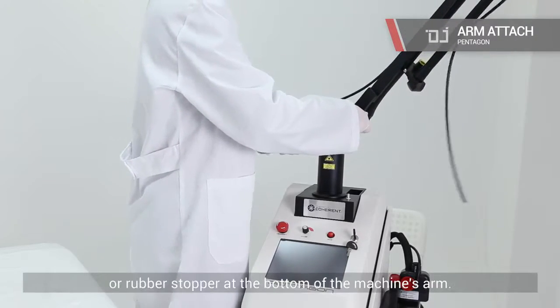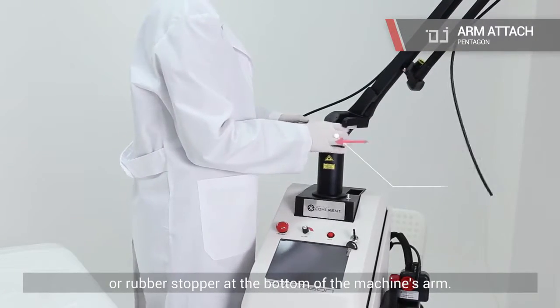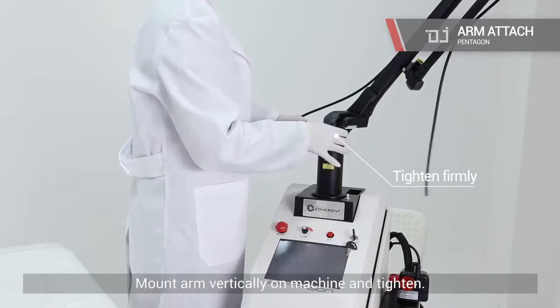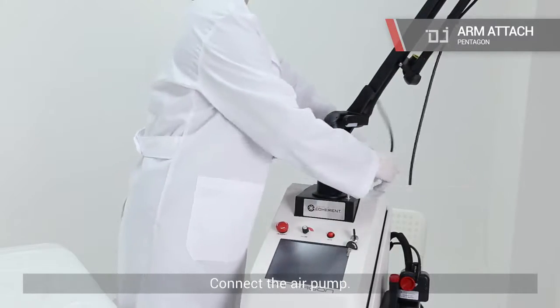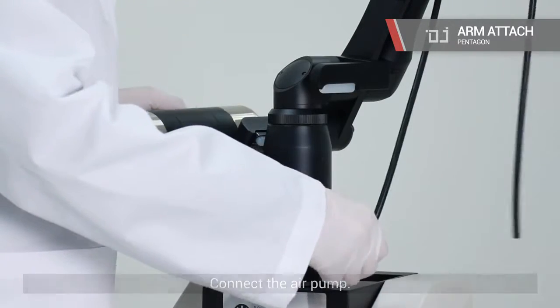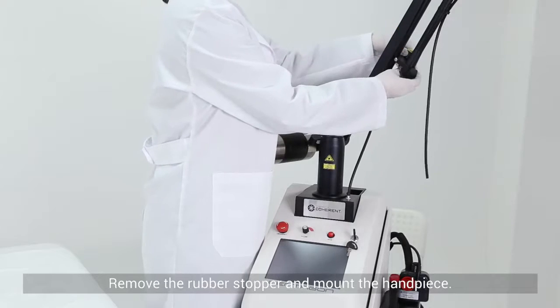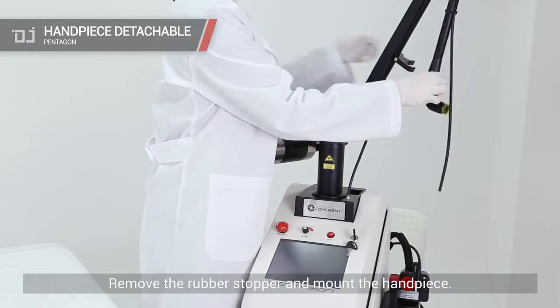Please remove the sticker or rubber stopper at the bottom of the machine's arm. Mount the arm vertically on the machine and tighten. Connect the air pump. Remove the rubber stopper and mount the handpiece.